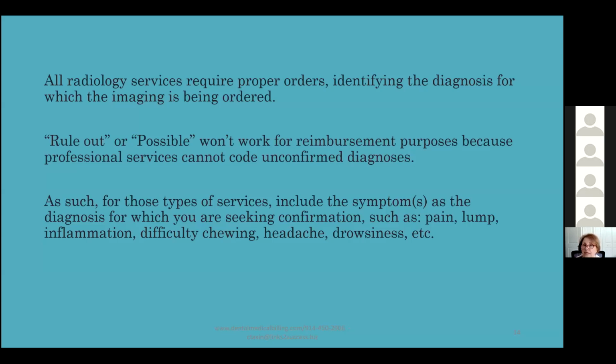I have made one that you can use so that you always have everything ready, and it makes it easier as to why you're diagnosing and wanting this imaging. Rule out or possible will not work for reimbursement purposes, because professional services cannot code unconfirmed diagnosis.